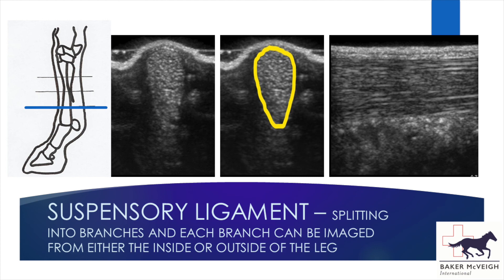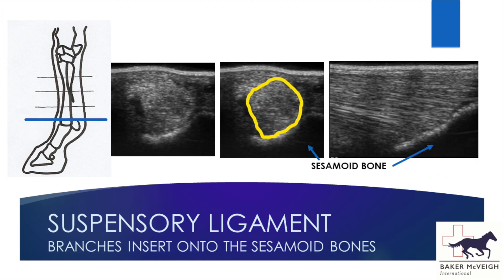This side approach can be done lower down because the splint bones are no longer obstructing our view, but higher up the leg the splint bones prevent imaging the suspensory ligament from the side. We go to the inside of the leg to image the medial suspensory branch and the outside to image the lateral suspensory branch — the suspensory ligament lies directly under the skin, giving a nice clear image from the side. Finally, you can see the suspensory branches attaching onto the sesamoid bones, where you get that bright line of the bone followed by black, as no further waves penetrate through the bone.